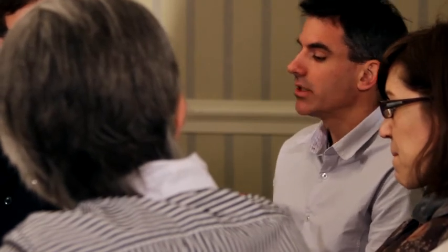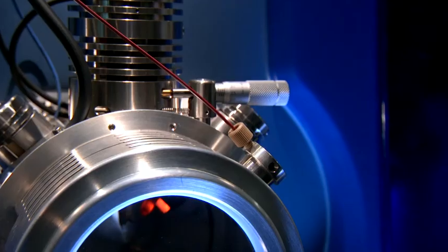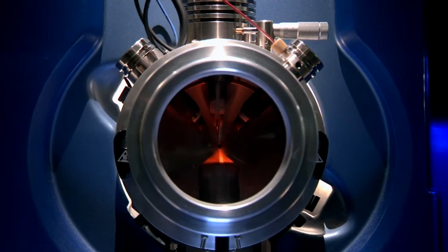So I haven't seen any evolution in that area over the 2 years, except that the 5500 QTRAP has the QTRAP, but the same sensitivity. But what Grace alluded to was that the SelexION would allow us to accomplish something that we've had trouble accomplishing in regular chromatography separations, and that is separating very similar molecules from one another.